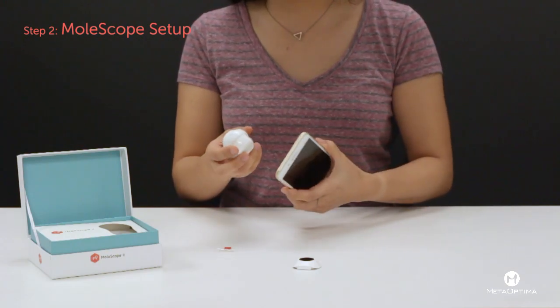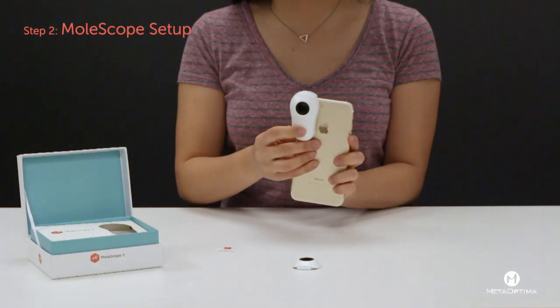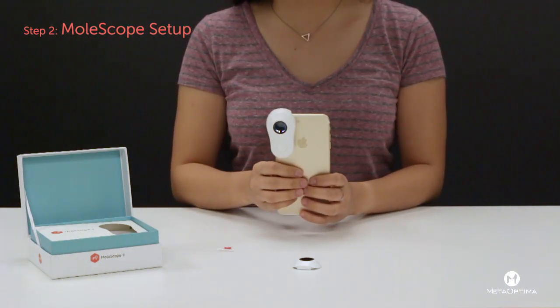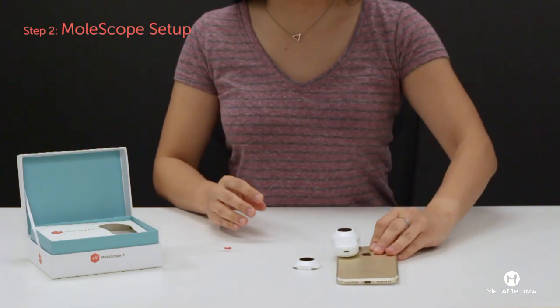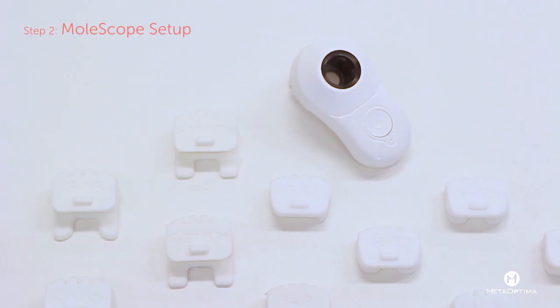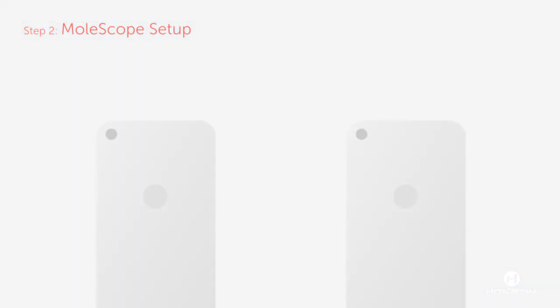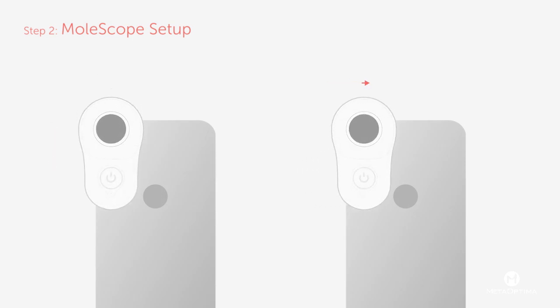Gently attach the Molescope device to your phone. There is no need to use heavy pressure. Slide the device until it fully covers your phone's camera and turn on the device's light when ready. Molescope's rubber attachments are specifically made for a variety of smartphones and accommodate for different cameras. Depending on your phone, they will either slide down or to the right to fit to the camera.